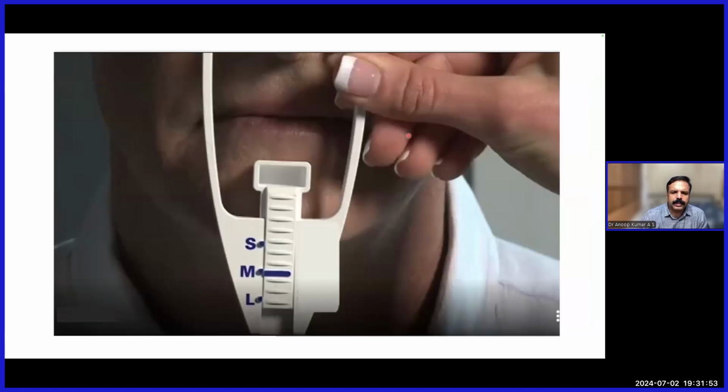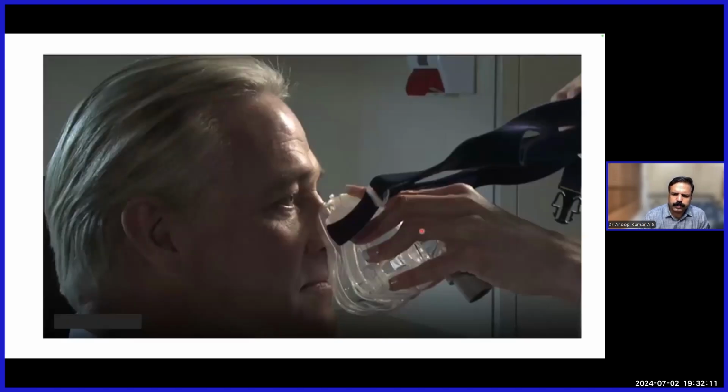So here, as you put it on the chin, you can see this patient's mark is corresponding to M. There are different types of calipers by different companies. So whenever you purchase a mask, you can ask them for the caliper, and depending on that caliper, you can select the mask size also.